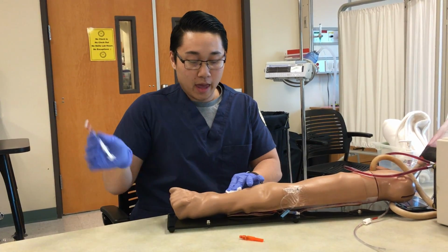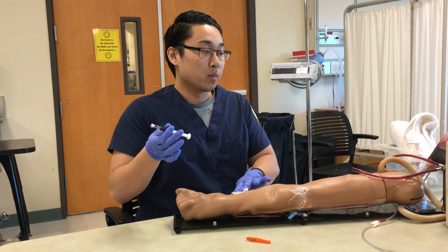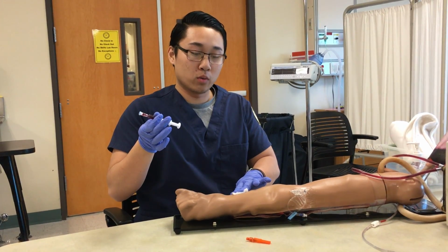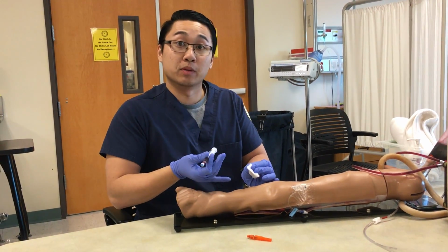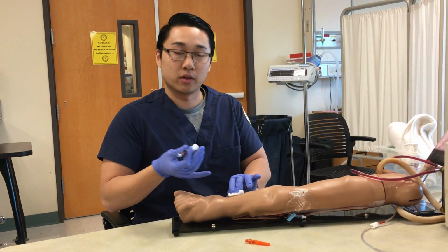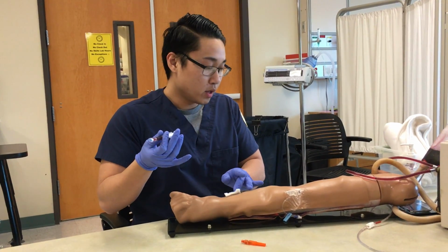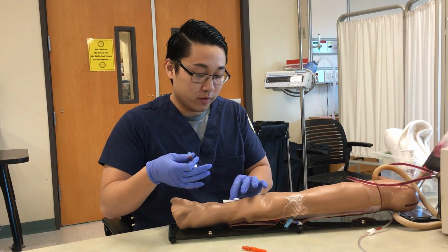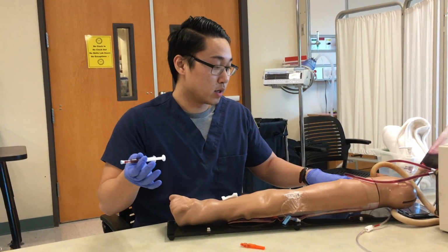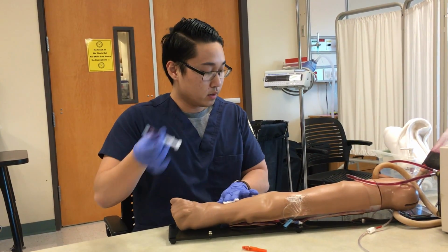Alright, and usually you would want to hold the gauze for 5 minutes, but it's more important to know that the patient has stopped bleeding and that clotting has occurred. Once you check it and you see that is so, you can either just toss the gauze away, or if it makes the patient feel better, you can apply a band-aid to the site. Alright.